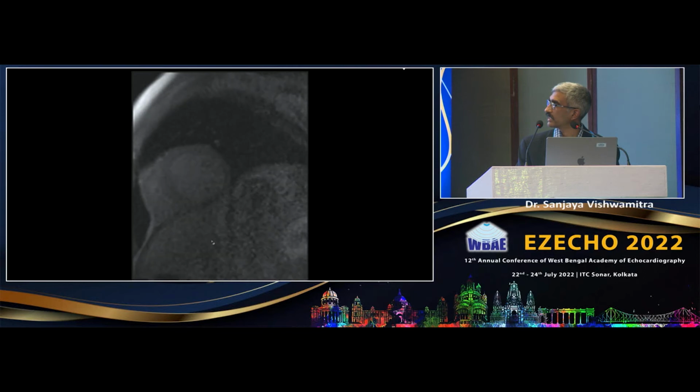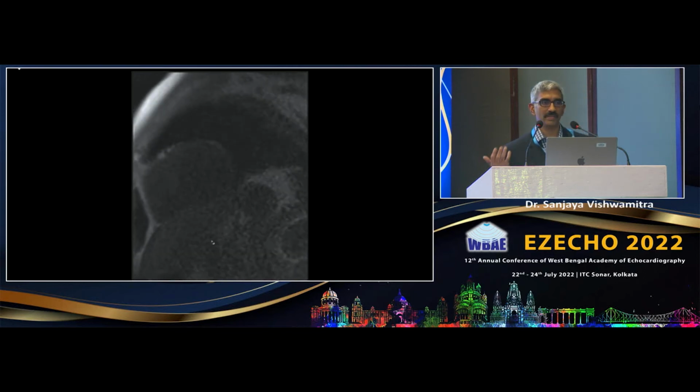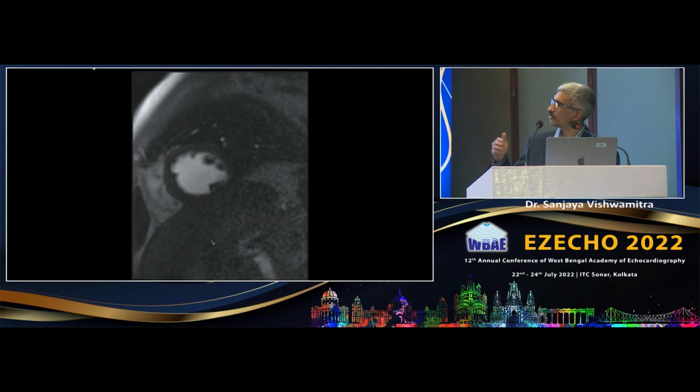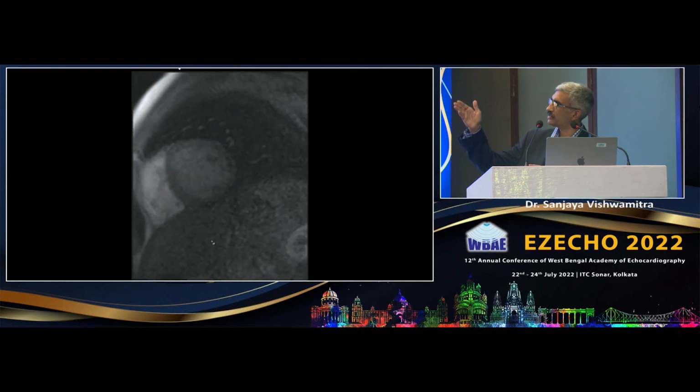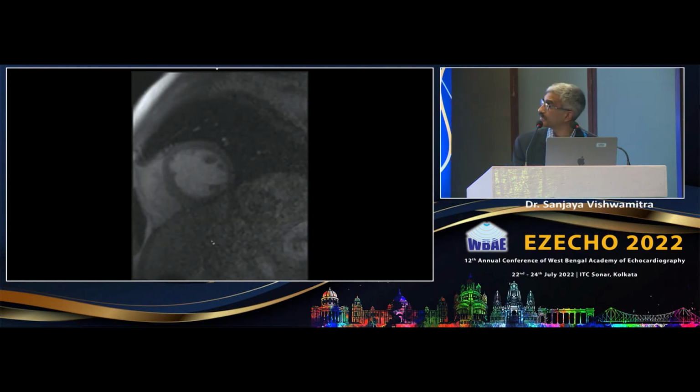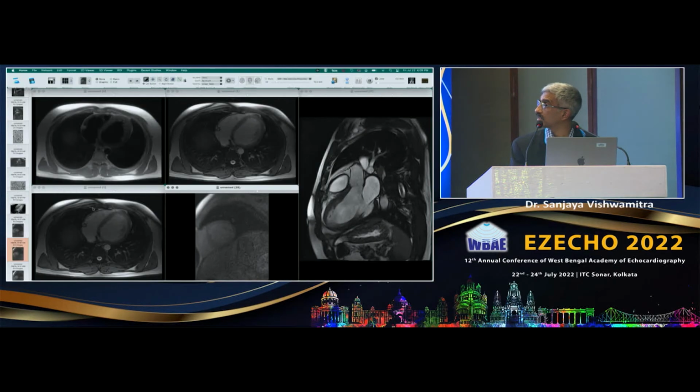Okay. And you can see here, the perfusion is a free breathing sequence. We use the motion correction algorithm to basically reduce the amount of motion. You saw the right ventricle, the lungs, the left ventricular cavity, and now you're seeing the left ventricle itself. Okay, so that would be our stress perfusion. Rest perfusion is really not required.